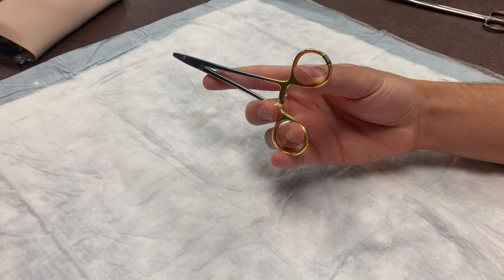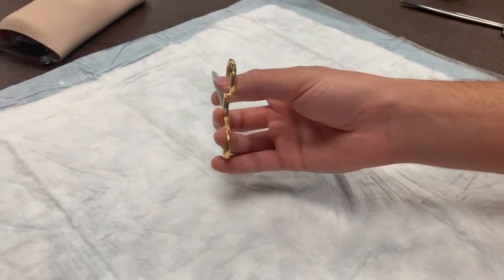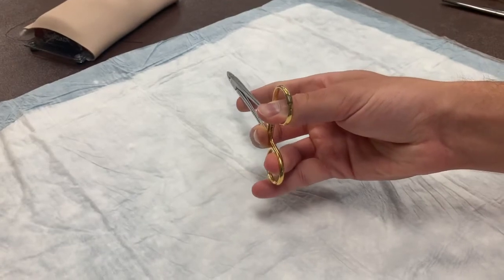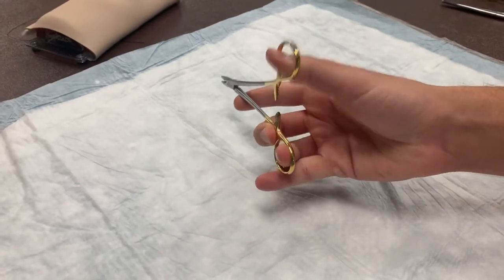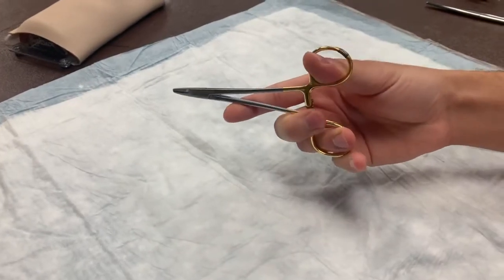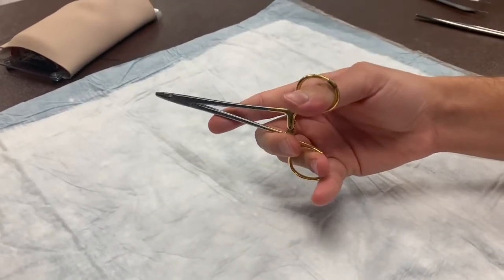To open the locking mechanism, you push out with your thumb while maintaining countertension with your fourth finger, and to lock it you simply push down. We teach this method over palming because beginners often find it difficult to unlock the needle driver while palming.